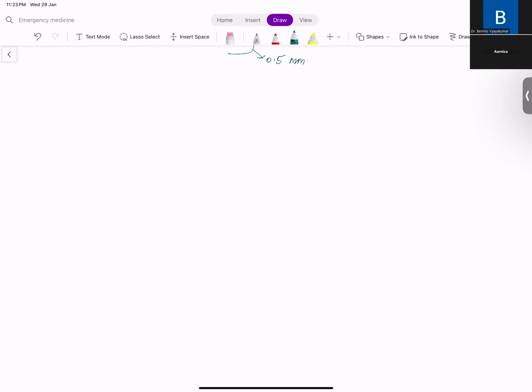Suppose, coming back to our initial discussion where we started about acute coronary syndrome, STEMI and NSTEMI. Patient is having elevation of the markers, but ST segment is not elevated. So patient is having an ECG abnormality other than ST elevation. So it could be an ST depression.